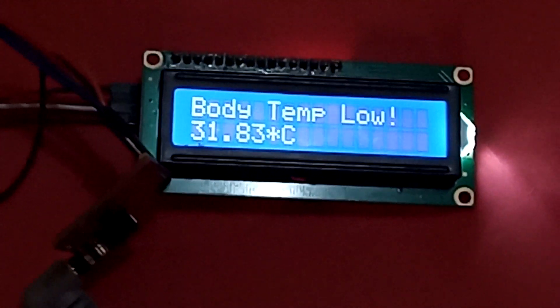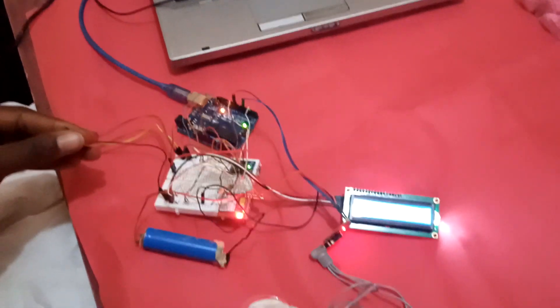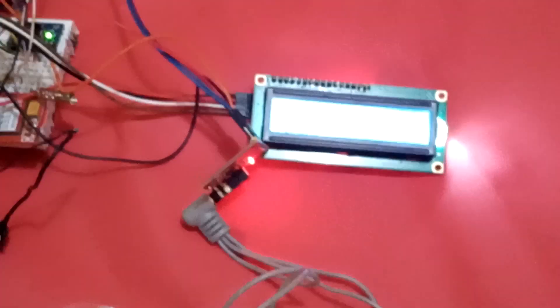So let's test it for body temperature. There is a 5-second delay between each reading, each display. Right now, body temperature is high — that's because of the range it has been set to.